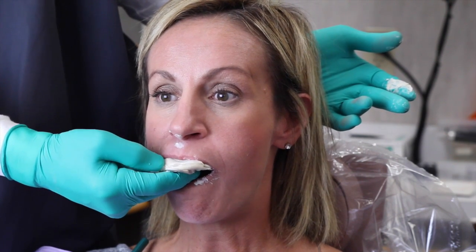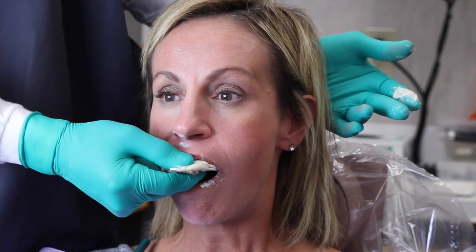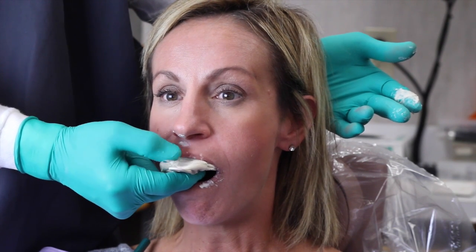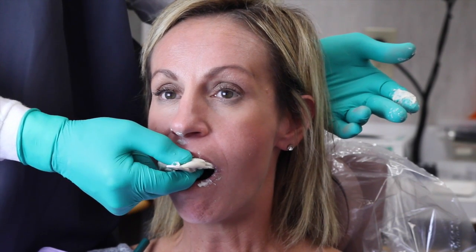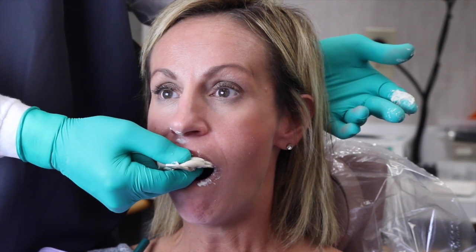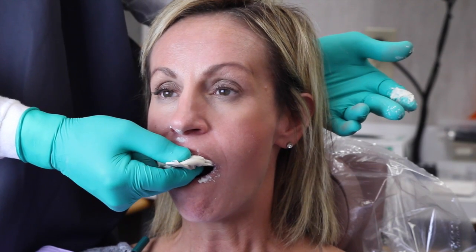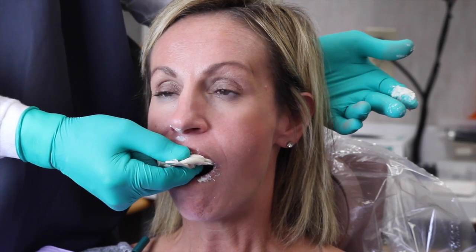And so right now, we're just waiting for everything to set. And again, the water's been cooling down a little bit during this video because we don't have it plugged in, so it's going to probably take a little longer. But with our water, again, measured out at 30 degrees centigrade, this impression would have been set already by now. But that's okay. That's good.